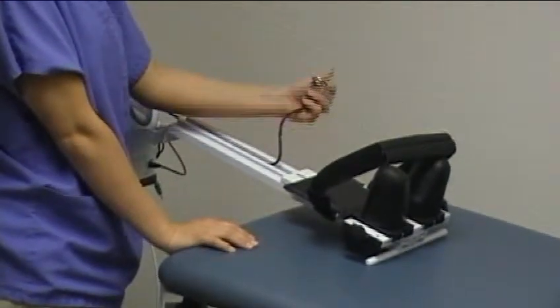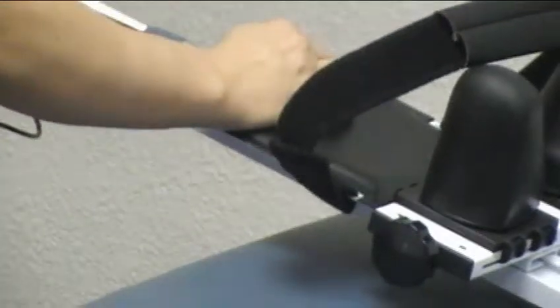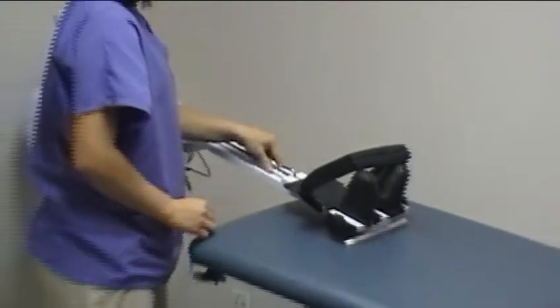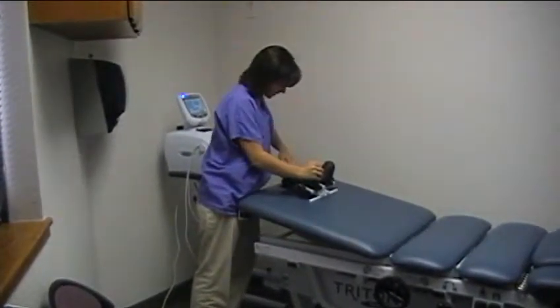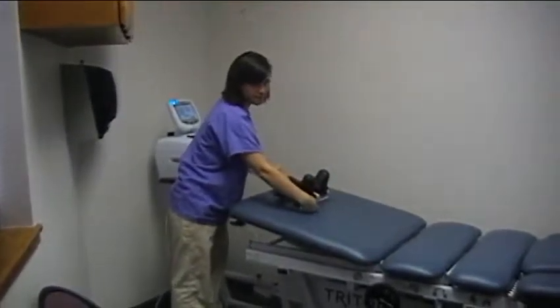Connect the rope to the cervical unit. There's a hook on here that you hook the rope onto. You want it so that it's taut, but not so much that it slides up. You still want it down towards the bottom.